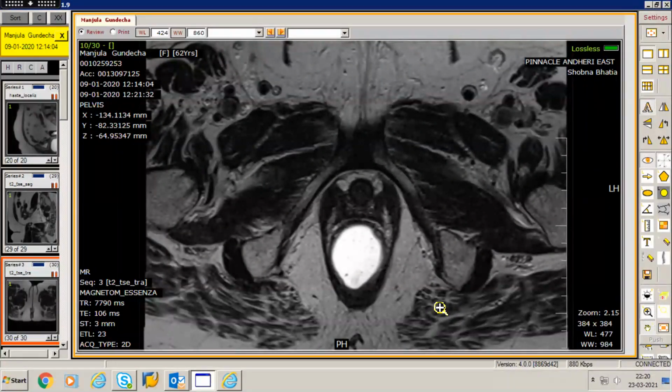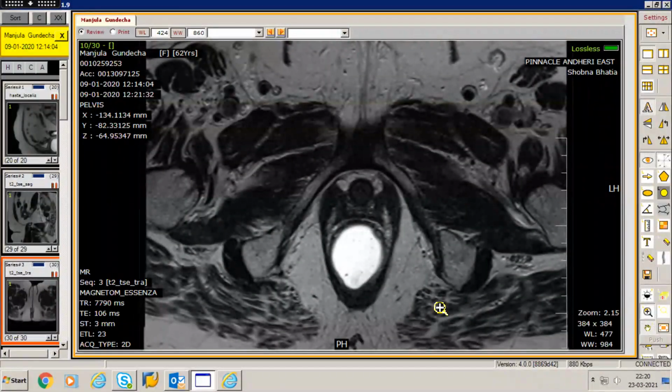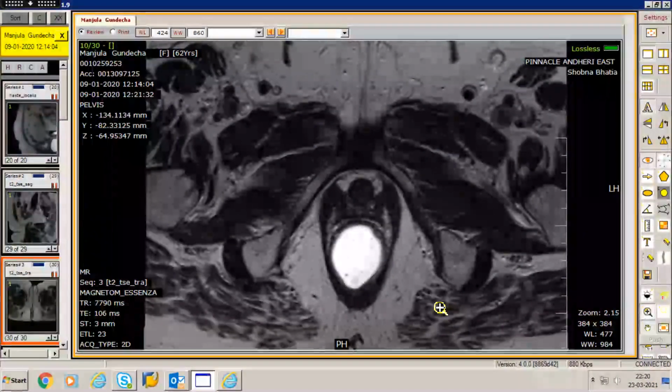Otherwise, what happens is you will not understand what exactly has transpired on those defecogram images. On the defecogram, just to reiterate, you need to have your PCL line, your H line, your M line drawn on all the three phases.